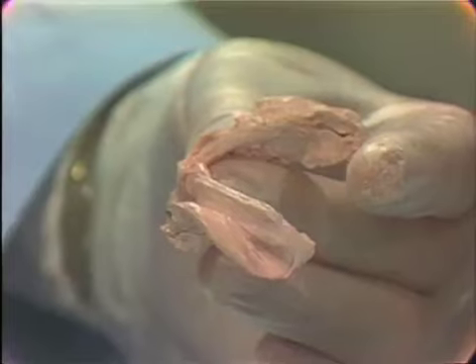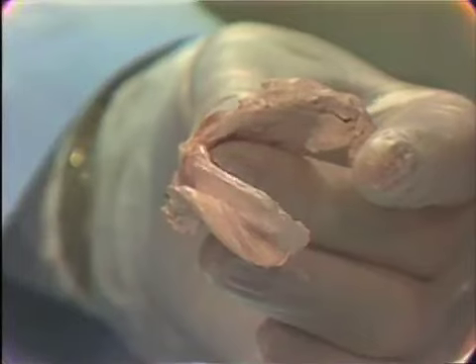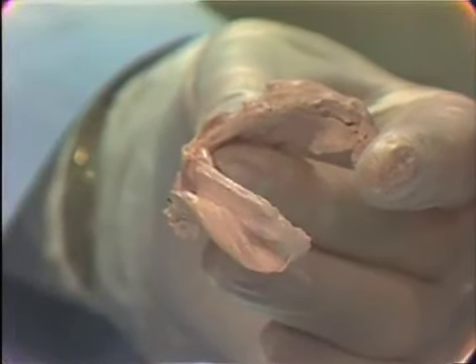The first impression is generally used to tell where to trim the tray. Remember that we made this tray and estimated the peripheral outline from an overextended impression. The only way we can tell the relationship of the tray to the resting tissues is to take an impression. So we take the first impression, we use this to tell us where we trim the peripheries in relationship to the resting tissue. We can now evaluate this impression. We now examine the impression to determine whether we have the peripheral areas the way that we want and tell where to trim the tray.